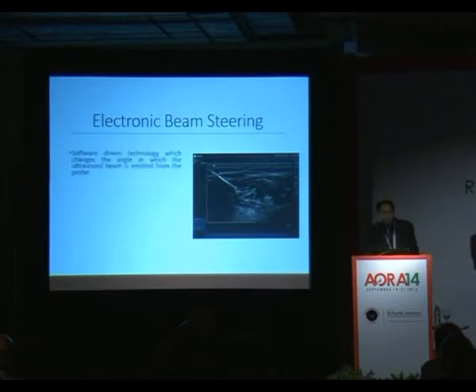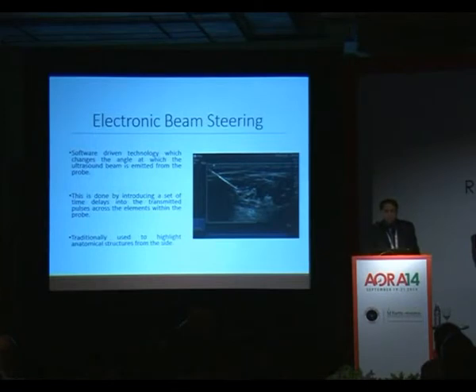Okay? It's a software-driven technology. Remember that. It's nothing fancy. It's just software which changes the angle at which the ultrasound beam emanates from the probe. This is done by introducing a set of time delays into the transmitted pulses across the elements within the probe. And this has been around for a while.